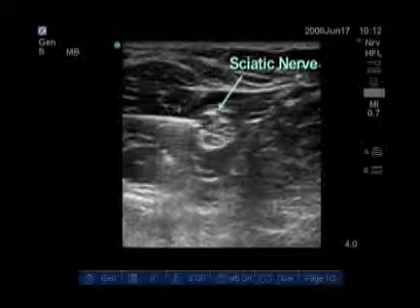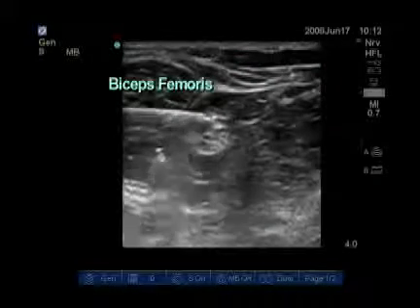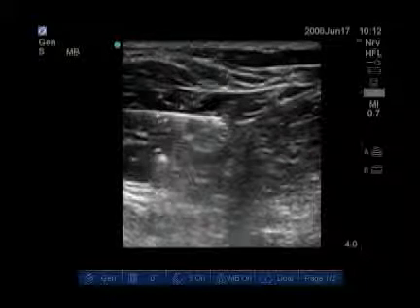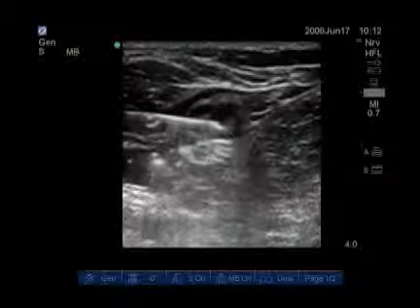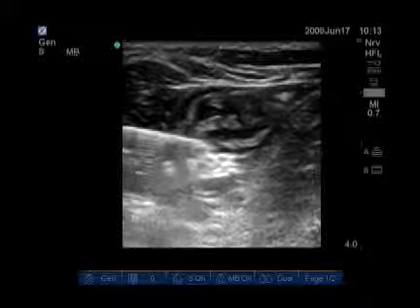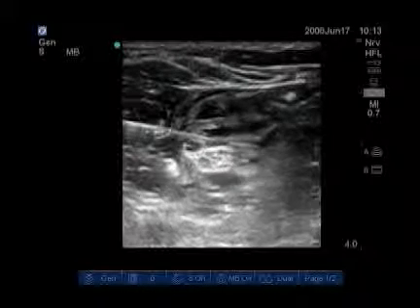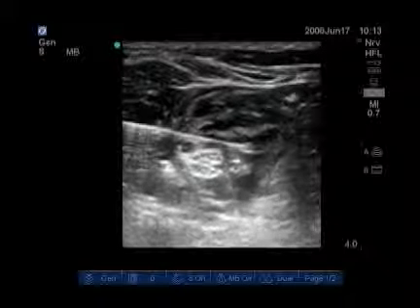Here we see the popliteal sciatic nerve surrounded by the biceps femoris laterally and the semitendinosus and semimembranosus medially. Our needle is advanced directly above the nerve and the local anesthetic is injected, pushing the nerve deeper. We then withdraw the needle and re-advance the needle again close to the nerve, so we can get local anesthetic spreading to the medial side of the nerve, which is more of the tibial component.